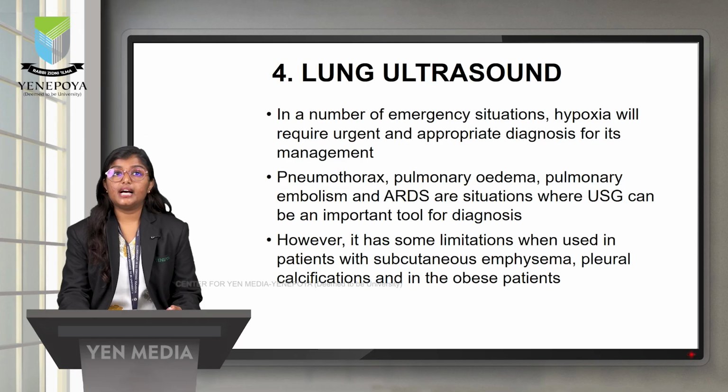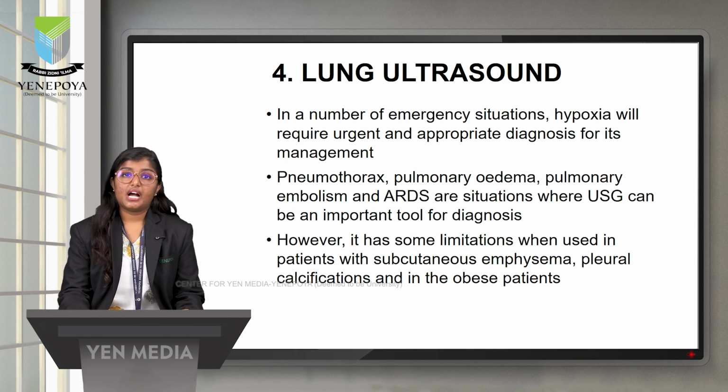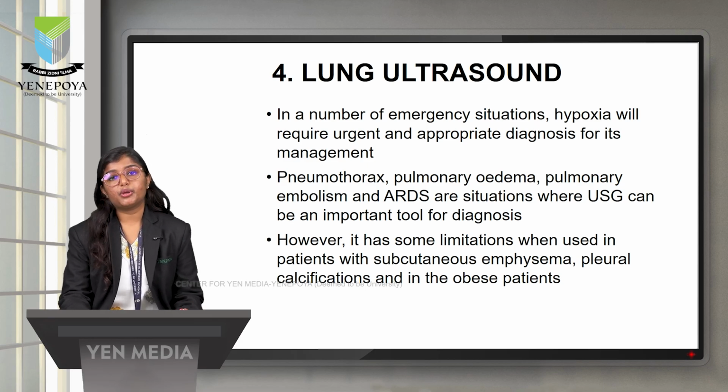Next, moving to lung ultrasound. In a number of emergency situations, hypoxia will require appropriate and urgent diagnosis for its management. Pneumothorax, pulmonary edema, pulmonary embolism and acute respiratory distress syndrome are the situations where the USG can be an important tool for diagnosis. However, it has some limitations when used in patients with subcutaneous emphysema, pleural calcification and in obese patients.